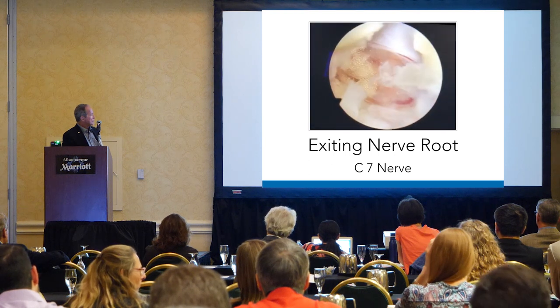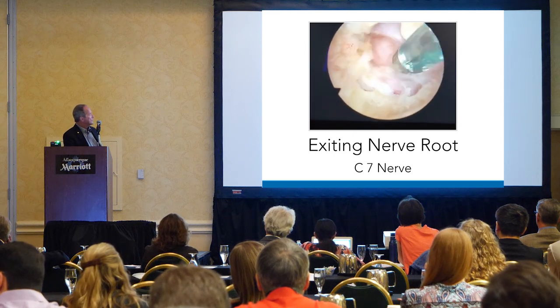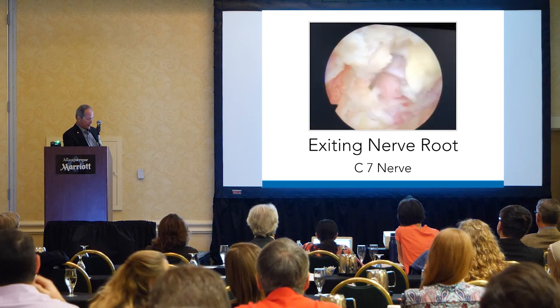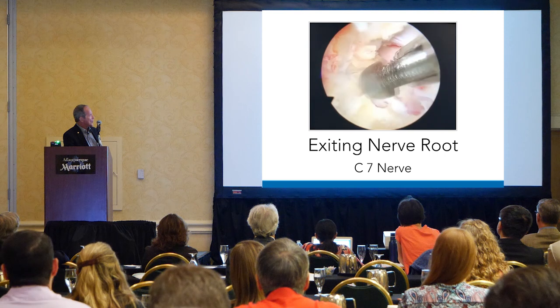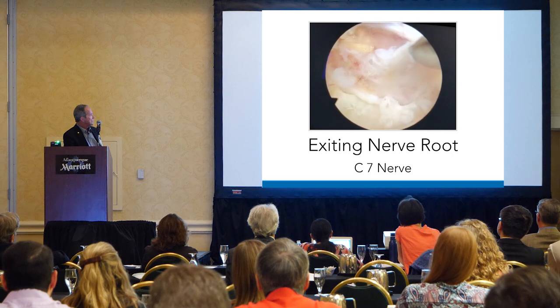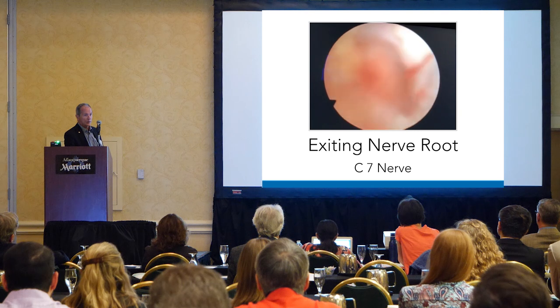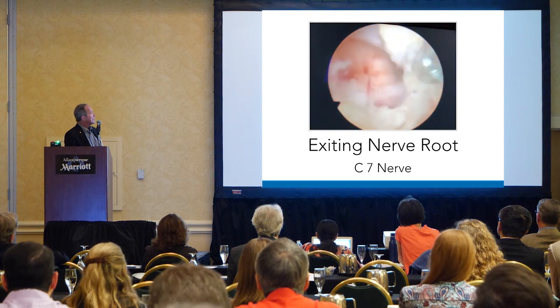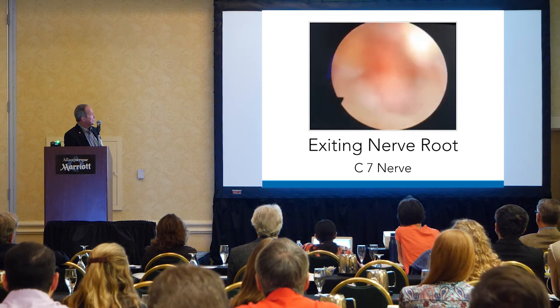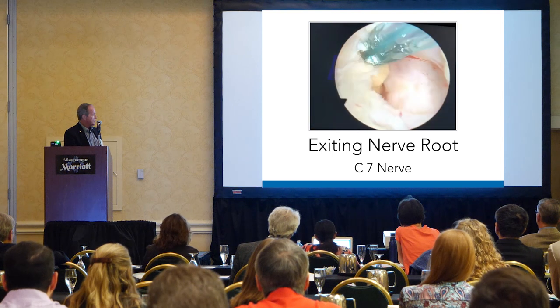It's revealing itself better and better, but we're going to see it really good here in just a minute. But you can see how it kind of comes off the underside of the cord. It's not coming right off the edge like I probably thought in the beginning. It's coming off kind of underneath the cord. Bleeding control is, you just got to stay on top of the bleeding. If you're bleeding down here, you don't know where you are, it's problematic. There it is. You're starting to see it really clearly now. But look at how it comes out from underneath the cord, not right off the side.